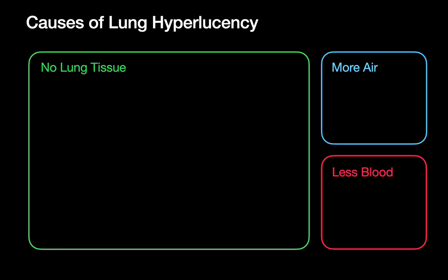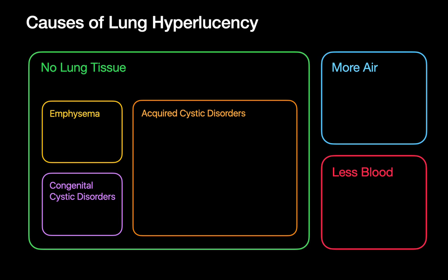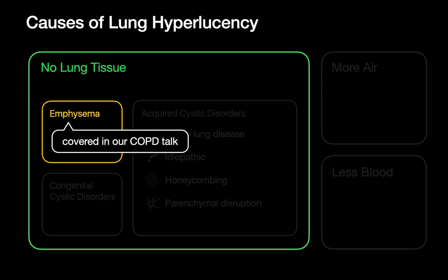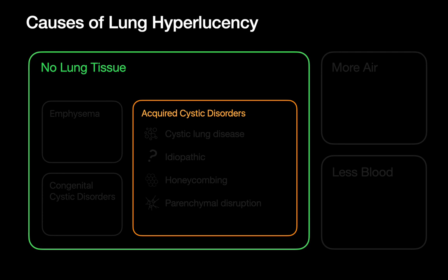There are three reasons why you'd encounter a situation where there's no lung parenchyma in an area. The most common situation is emphysema, but the two other situations are cystic disorders within the lung — some congenital, some acquired. For acquired cystic disorders, we'll focus on four situations: cystic lung disease, idiopathic disorders, honeycombing, and lung parenchymal disruption. Emphysema is a large topic covered separately in our COPD talk.